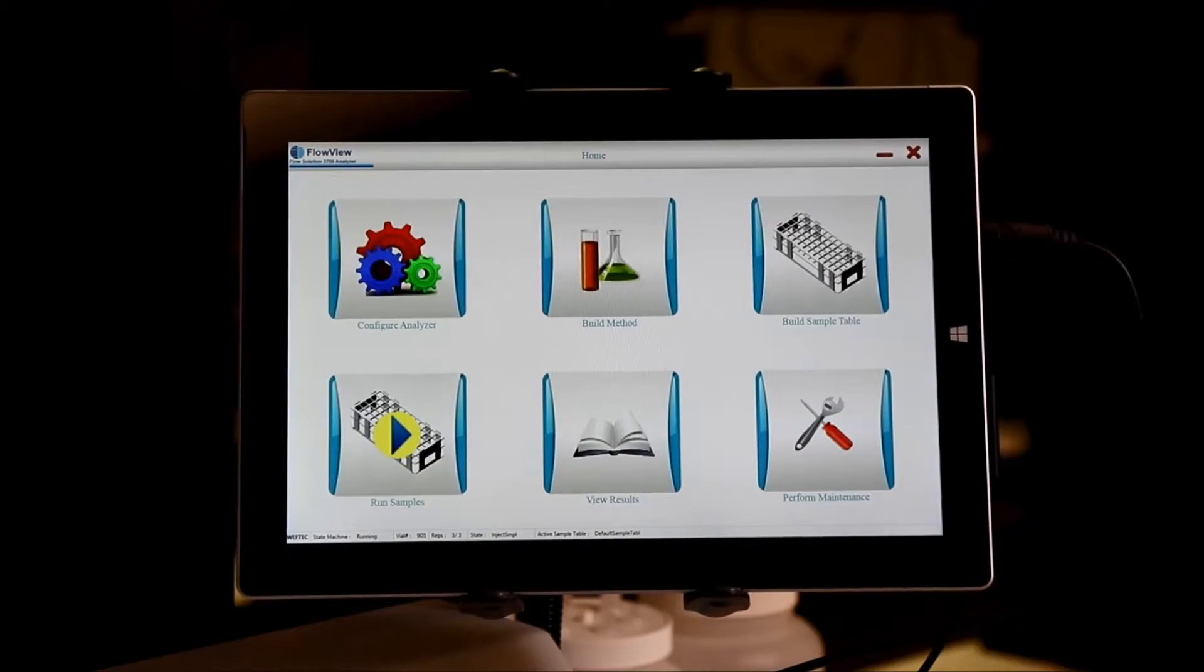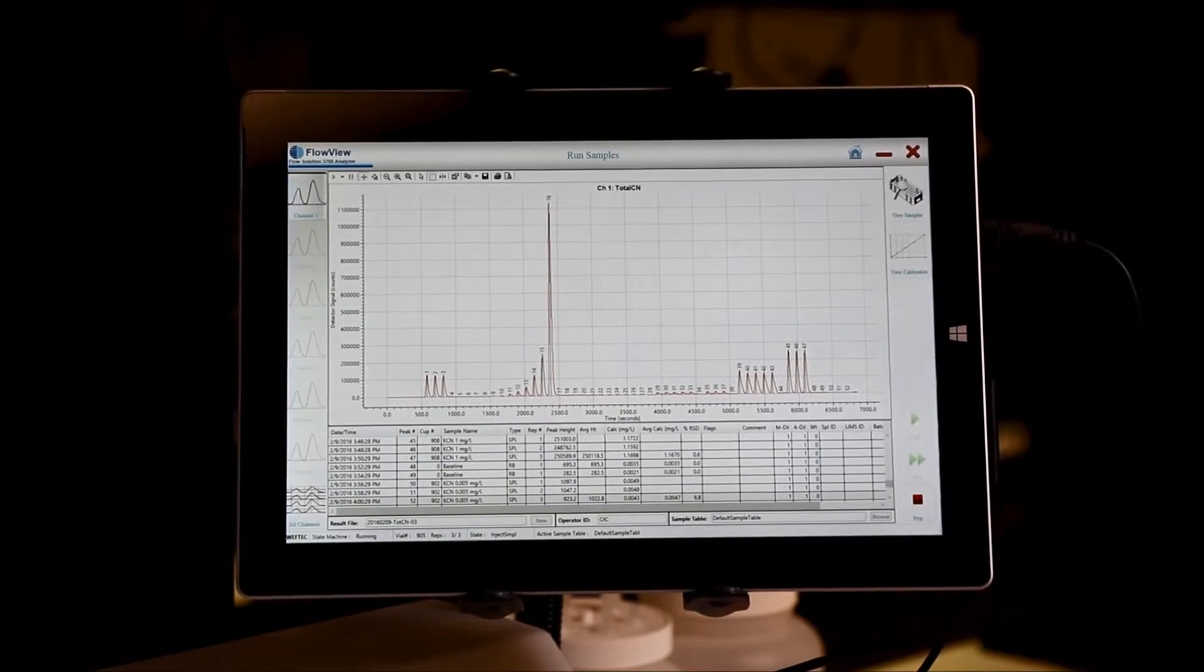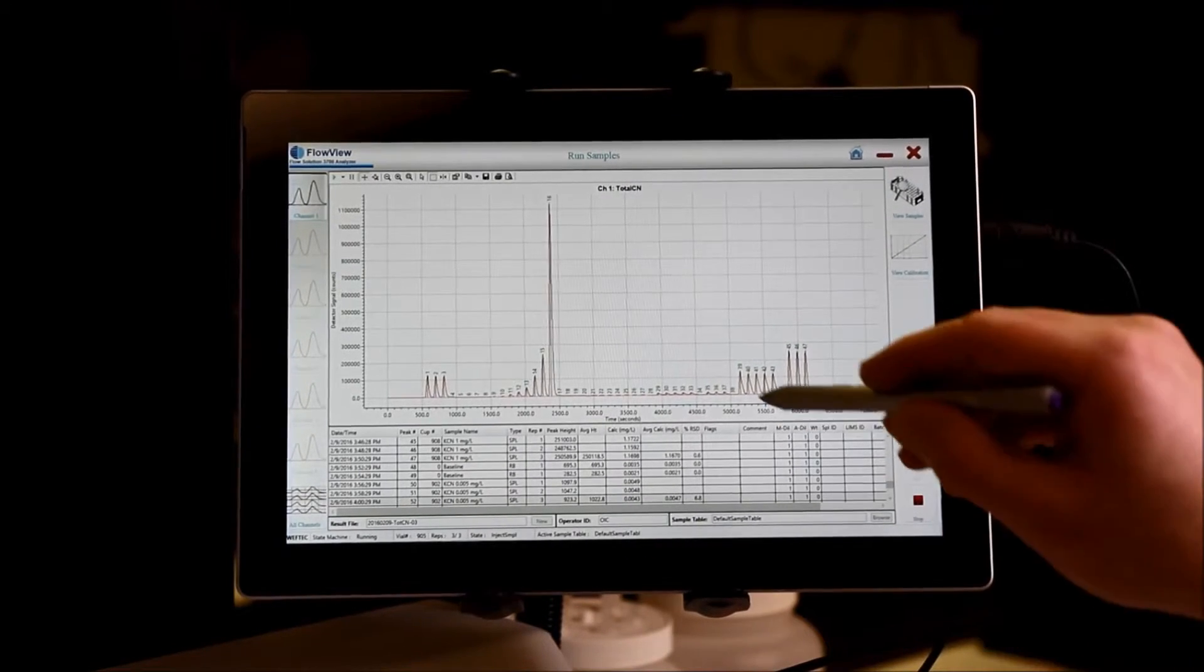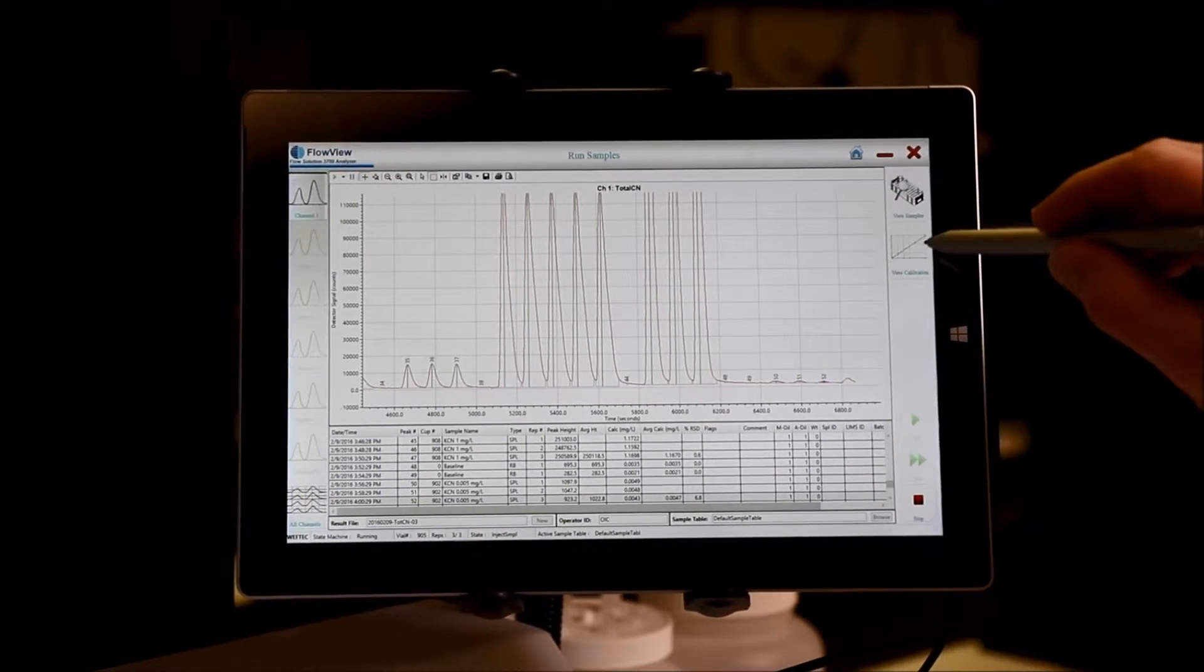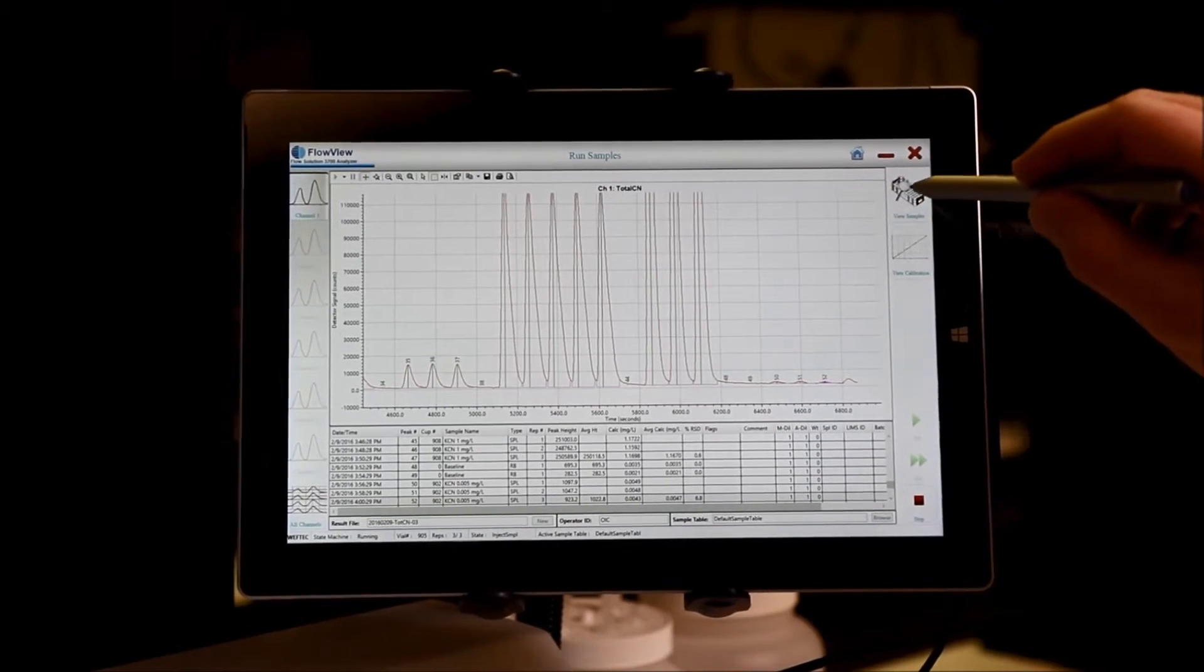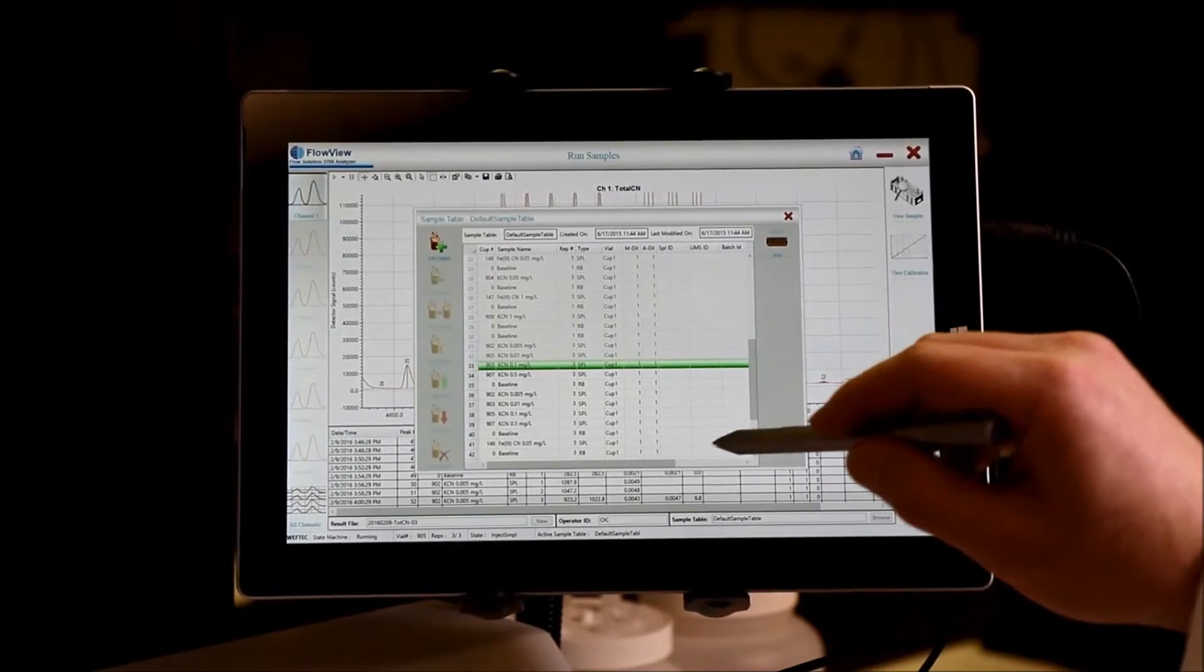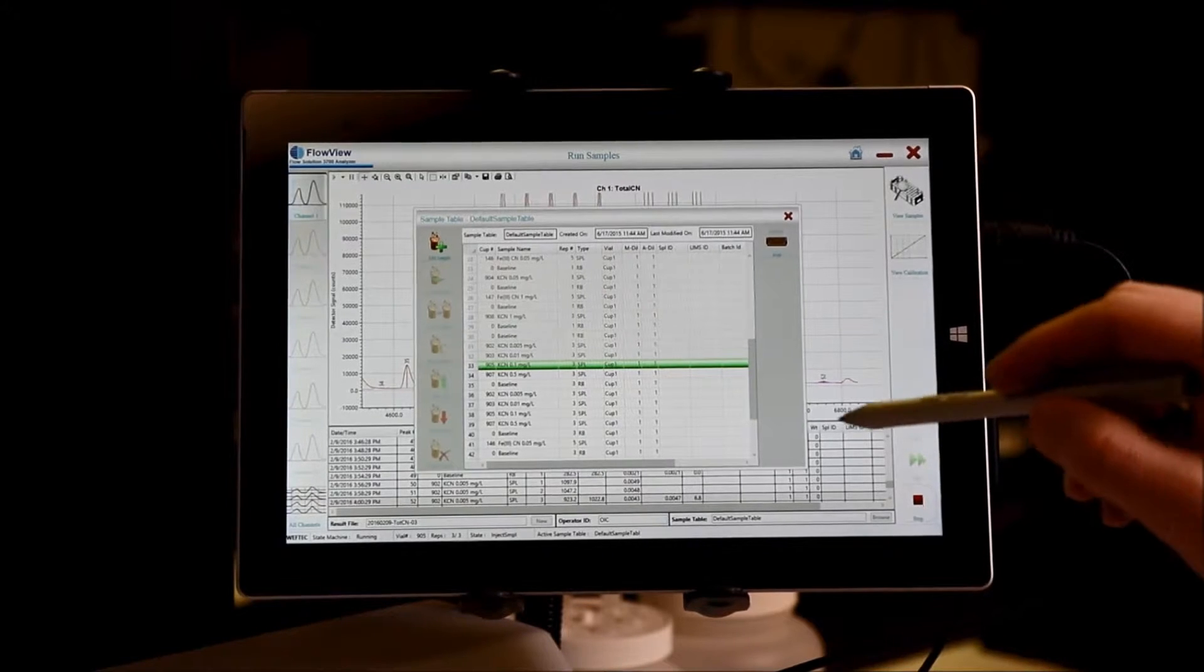The next button from the home screen is run samples. From the run samples screen, you can start a new run or, as I already have a run in progress, monitor the run as data is being collected. I can also view my calibration and add additional samples to the sequence as long as they've not been grayed out at this point.